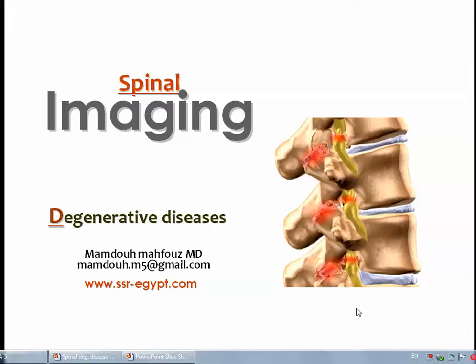Dear colleagues, this is the second talk in the series of spinal imaging, and as I have said before, we will discuss inshallah the degenerative diseases of the spine, which will be divided into two parts. Part 1 and part 2 will be after that.